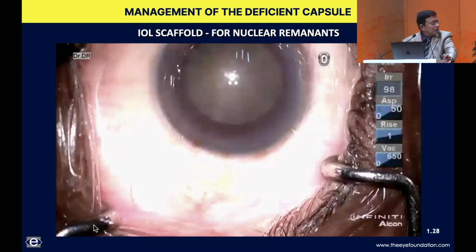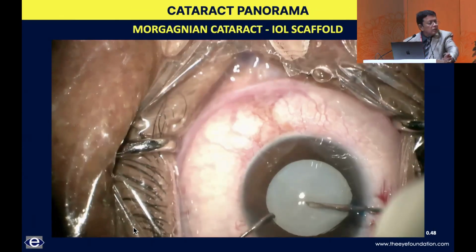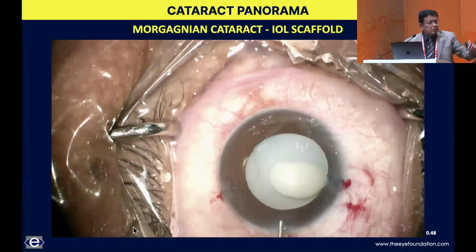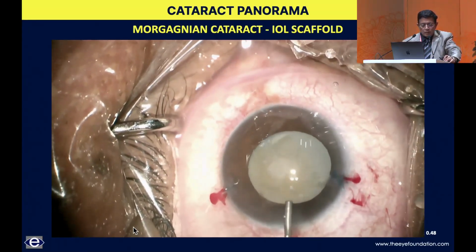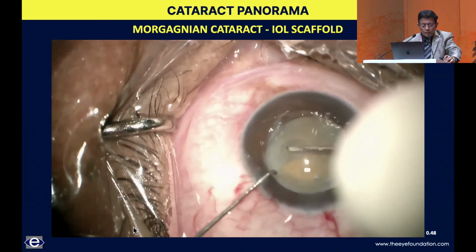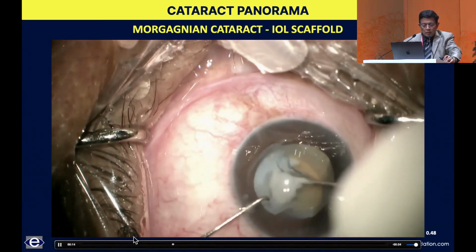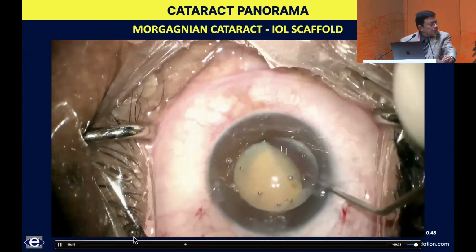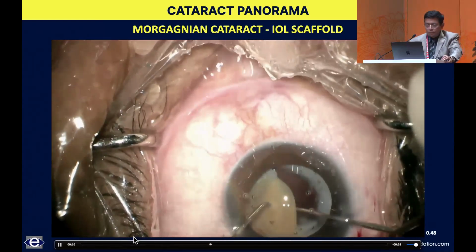One small challenge could be in further breaking down the cataract into pieces. While the IOL will definitely keep the PC away, when the nucleus is now coming anterior, to initiate and complete your horizontal chop when the nucleus is fairly hard can be quite challenging. So an alternate to the IOL scaffold could also be putting a CTR, which can also flatten the PC and prevent or reduce the trampolining of the PC.